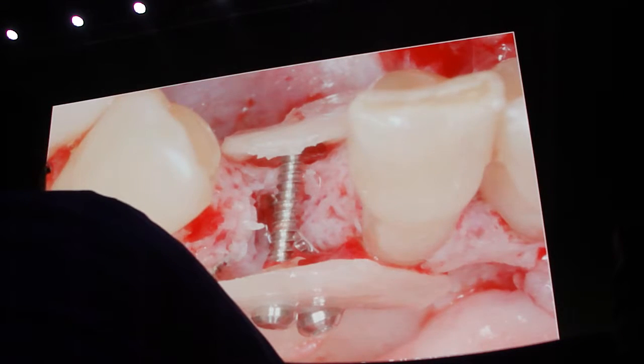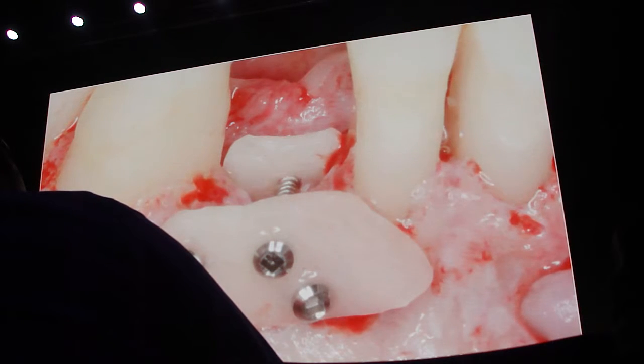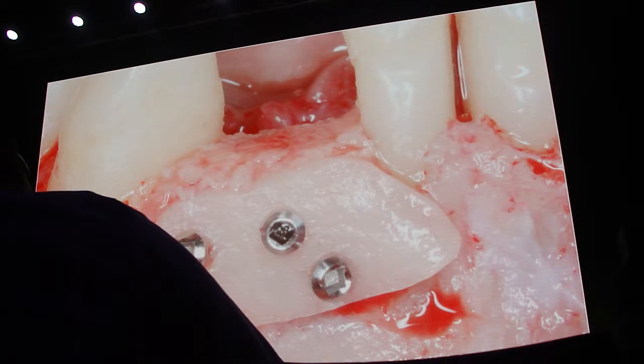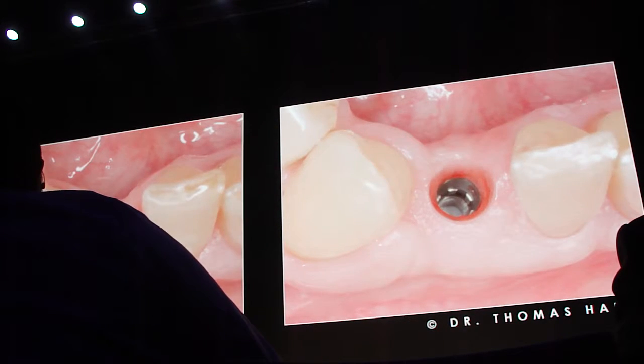So again, we are using the bone membrane technique, creating a new dimension laterally, creating a new vertical dimension, creating a stable biological space and filling it up with pure autogenous bone chips. So finally we are able to get back the original bony contours. 3 months later, we can now place the implant into a proper implant prosthetic position. So by increasing the bone volume, by increasing the support for the soft tissue, we were significantly able to increase the soft tissue volume itself.